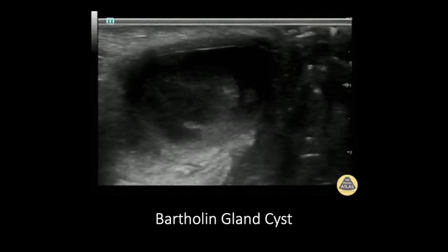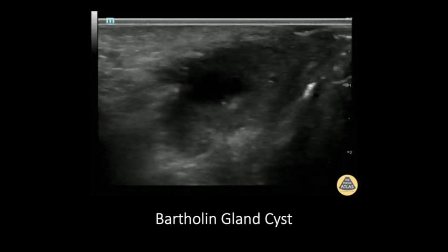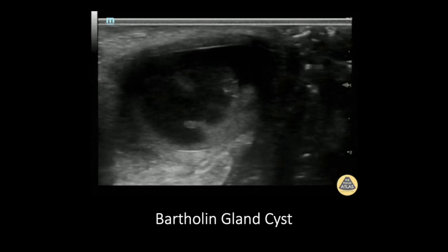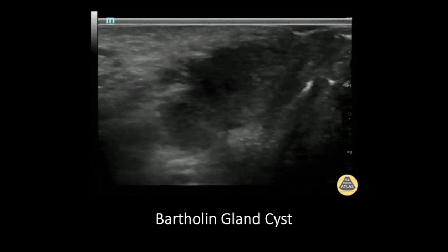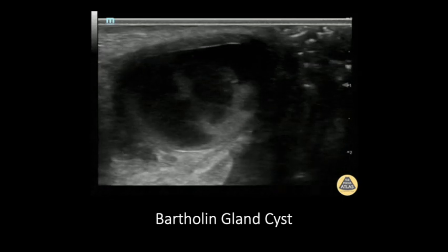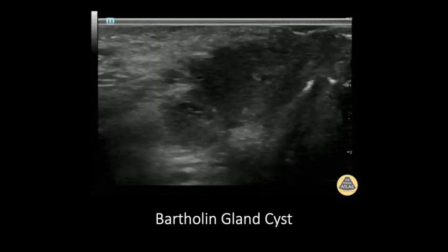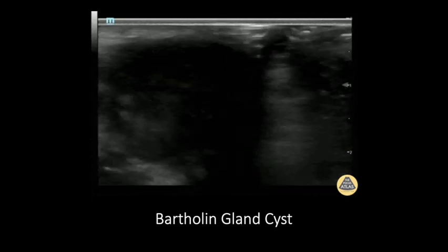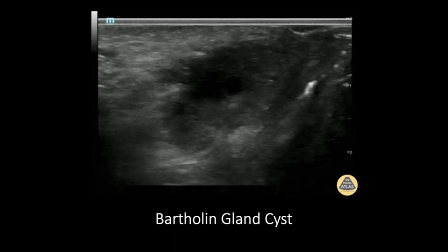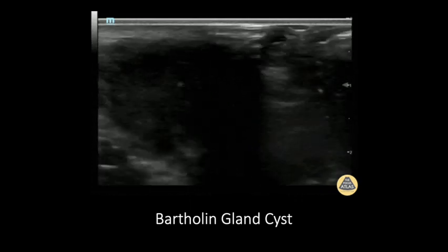Bartholin gland cysts are often encountered by primary care and OB providers as painful erythematous swellings near the labia or the vaginal introitus. There may be a history of drainage or previous disease in the area. While ultrasound is not routinely utilized for these diagnoses because they usually aren't very subtle, I have used ultrasound before to assist in drainage when my initial attempt at lancing and draining was unsuccessful. Placing a needle under ultrasound guidance is sometimes helpful when these abscesses are small or mobile.